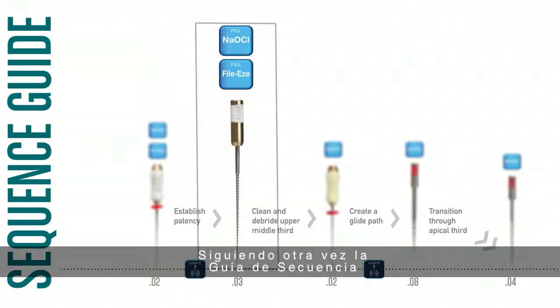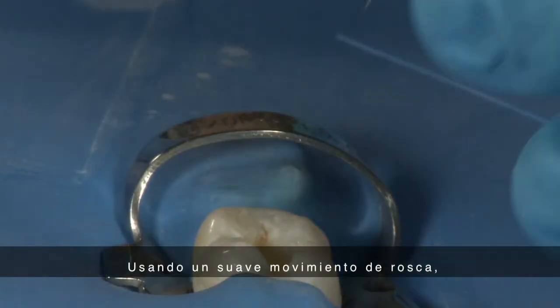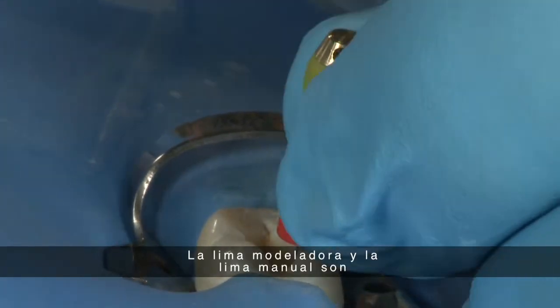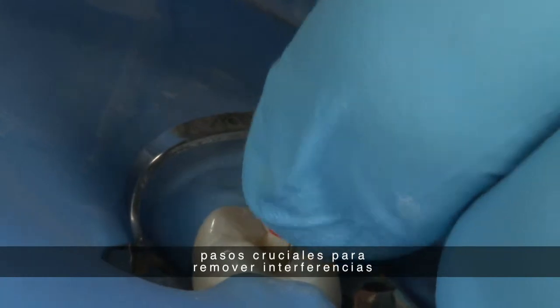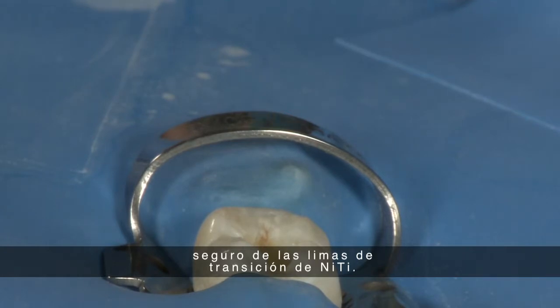Again, following the sequence guide, move from the number 2 shaping file to the number 20 hand file. Using the gentle watch winding motion, take the number 20 stainless steel hand file to working length. The shaping file and the hand file are crucial steps for removing interferences in the middle third of the canal and creating a glide path for the safe use of the NiTi transitional files.